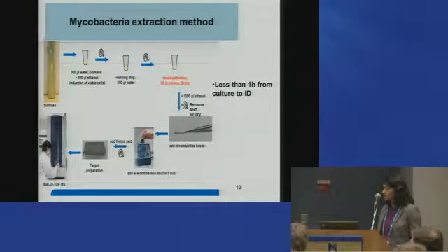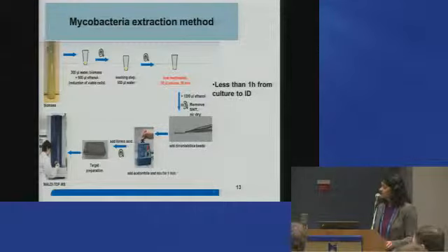So since not all microorganisms are created equal, we also work on mycobacteria a great deal in the lab. So we have a semi-P3 lab that works on mycobacteria, because this is a special group of organisms. And you all may have heard of Mycobacterium tuberculosis, that is the causative agent of TB, tuberculosis. So we really have to handle these organisms very carefully in a semi-P3 lab. And when we first had our first MALDI, obviously we cannot have a MALDI in every area of our lab, in the anaerobe area, in the aerobic bacteriology, in the mycobacteria fungal lab. We only had one MALDI at the time.